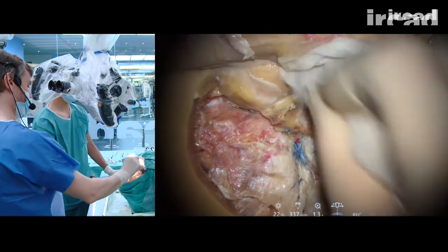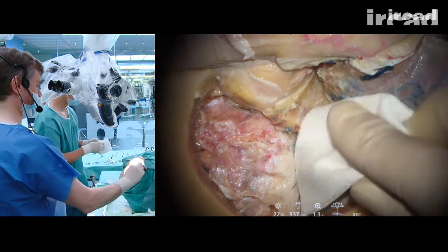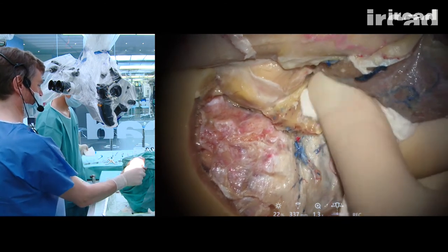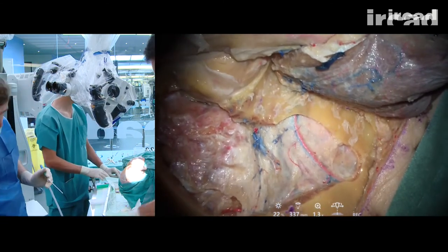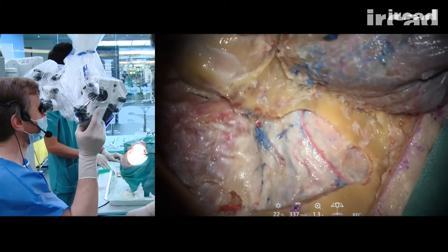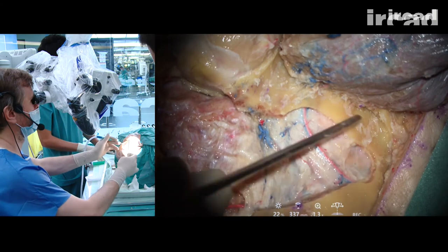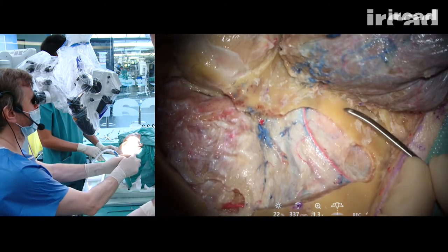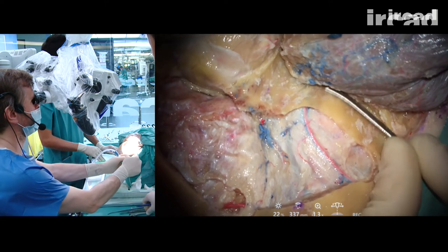And compress. You can see that we can retract the temporalis muscle quite low here. And this is the goal of this approach, is to really retract the muscle very low.